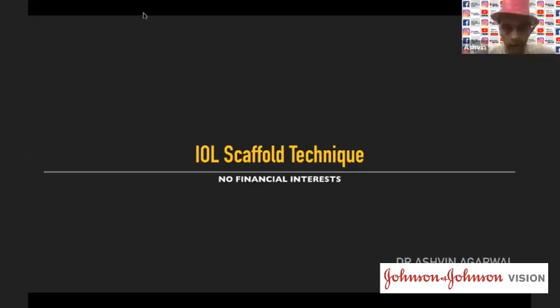Hi, everybody. I'm going to be talking about IOL scaffold, and just in the interest of time, I'm going to speak a little fast.